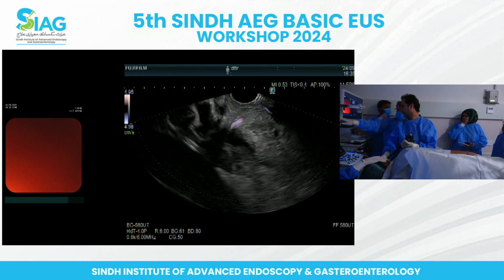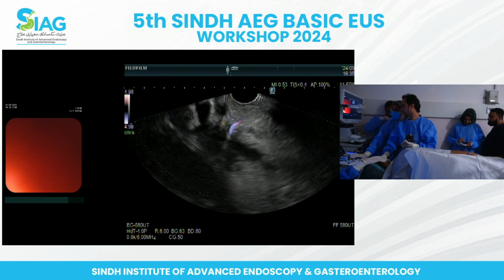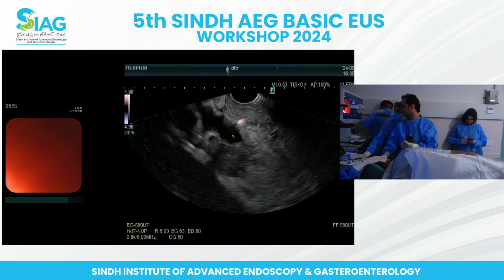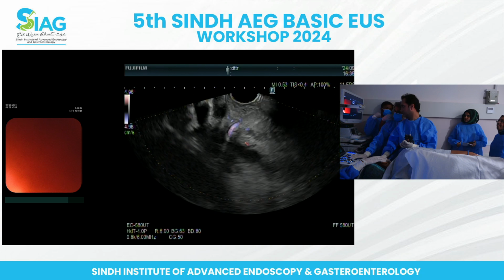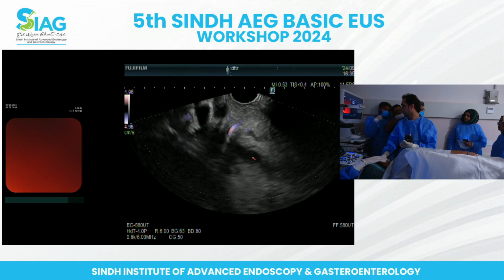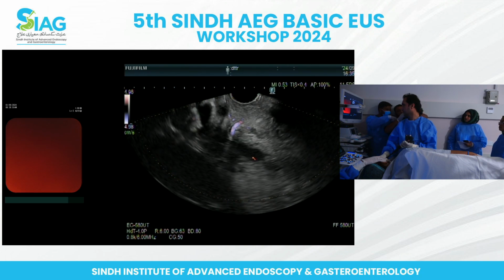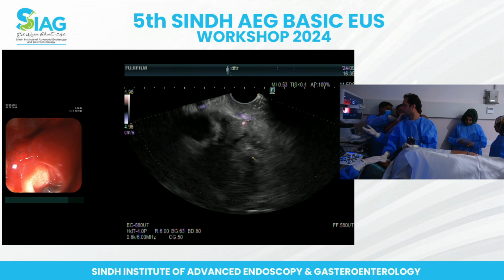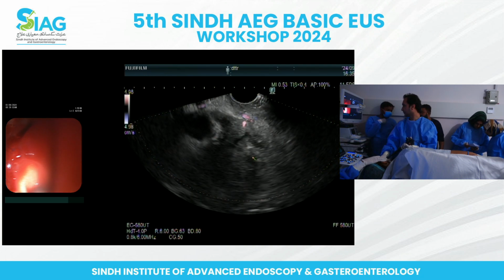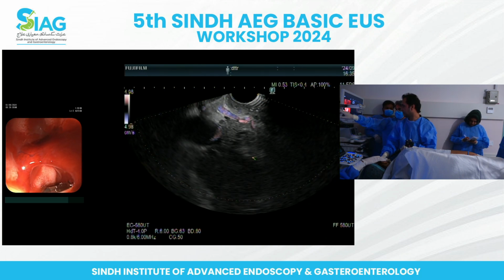So it walks in, and then it just goes right. Let me just show you the arrow. Go again. So this is the bile duct walking in. This is the mass. Very slightly, slowly clockwise, Junaid, please. And there it goes past it into here. So that's why she's not really jaundiced, because it's not. So what Saad Bhai asked was a very pertinent thing, and I think we should make that assessment always. So it's not blocking it, but yes, it's clearly pressing on it. Yes, and in fact, exactly. And it goes back and then comes into this mass here, which then becomes dilated.